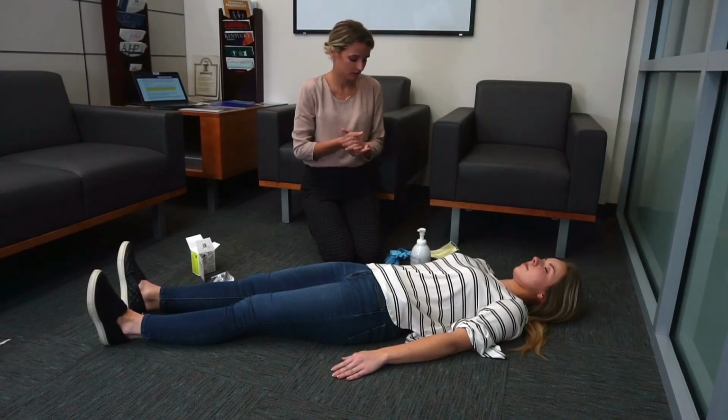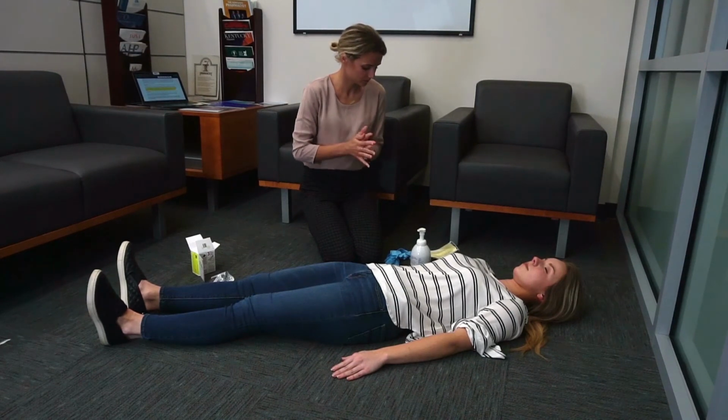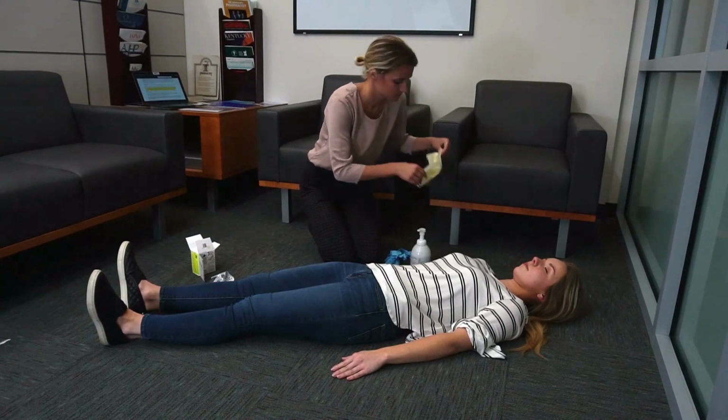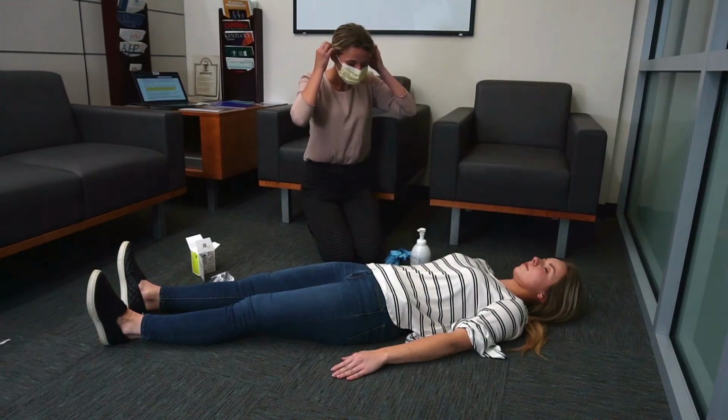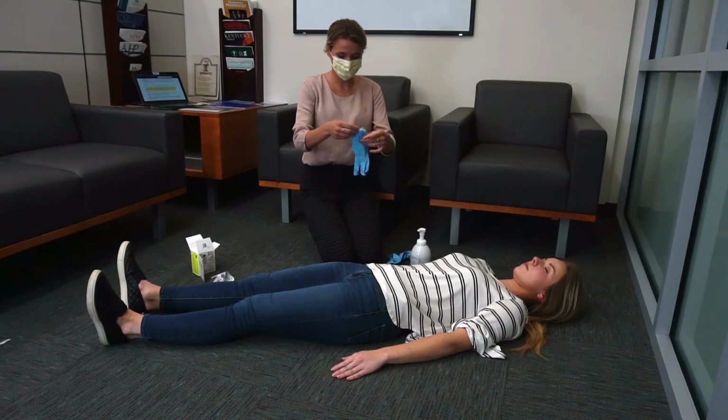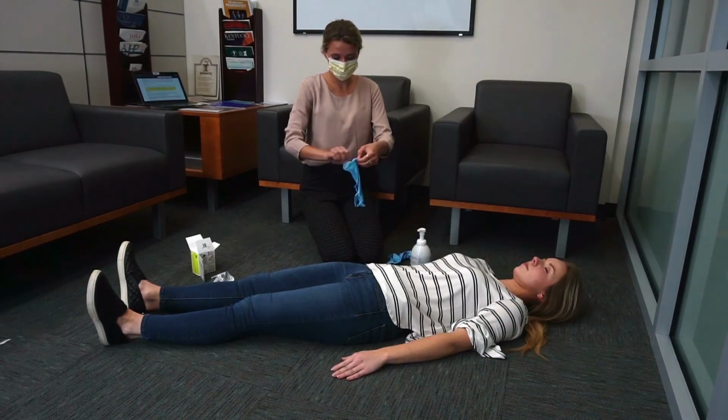If you have gloves and something to cover your face, like a face mask, nearby, please put those on. If you do not, please still call 911 and administer naloxone. Wash your hands or use hand sanitizer if possible. If at any time you need to cough or sneeze, do that into a tissue or into your sleeve or arm.